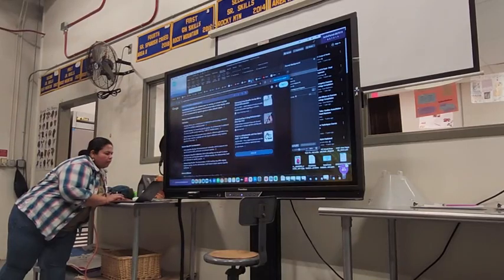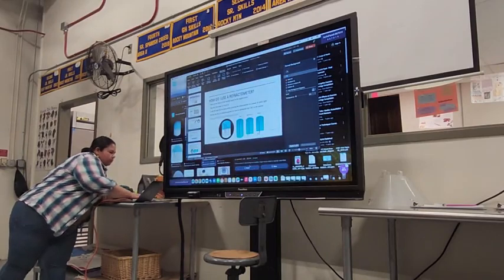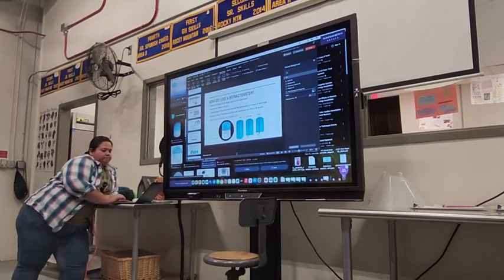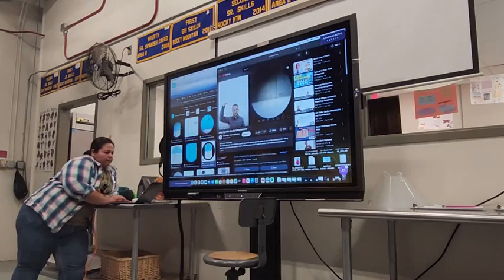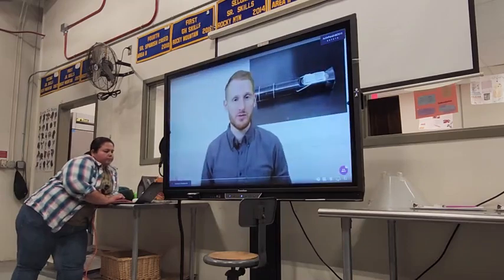Make sure you get it onto that hole, and then you're going to close the lid back over, and you're going to see that the urine is kind of spread out across that piece of glass off the refractometer. Once that happens, you can take the refractometer, hold it up to your eye like a telescope, and walk underneath some sort of bright overhead light.